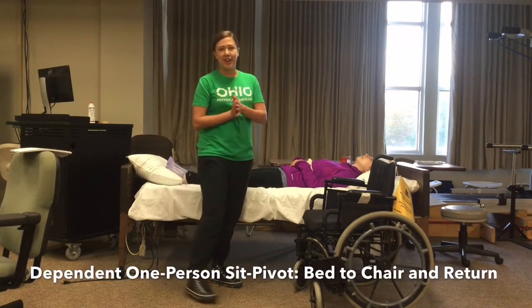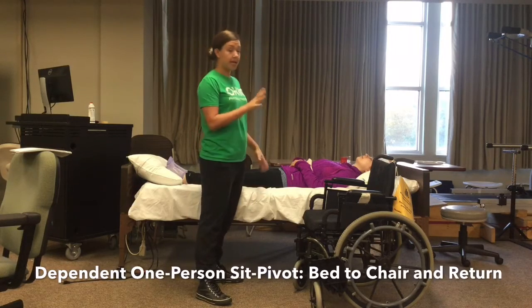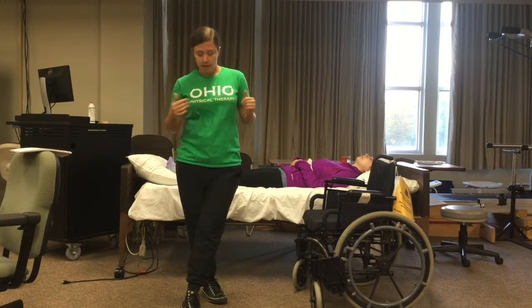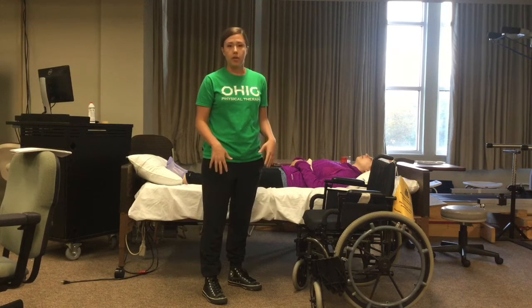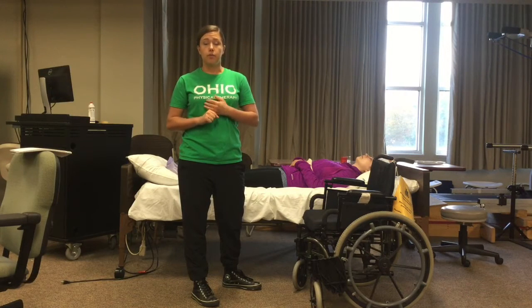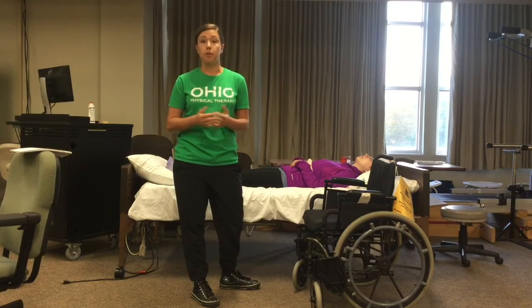Hi everyone. Okay, we're gonna learn how to do a dependent sit pivot transfer from the bed to the wheelchair and then back to the bed. You would use this if you have a patient that doesn't stand independently, but they can bear some weight in their lower extremities due to some weakness or paralysis, and also when you as the PT are strong enough to perform the skill. If not, you would always have assistance from someone qualified.